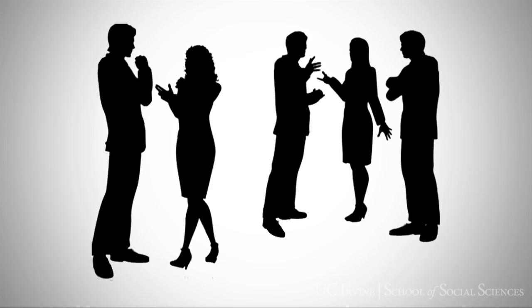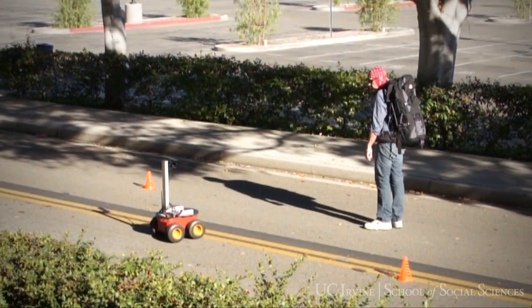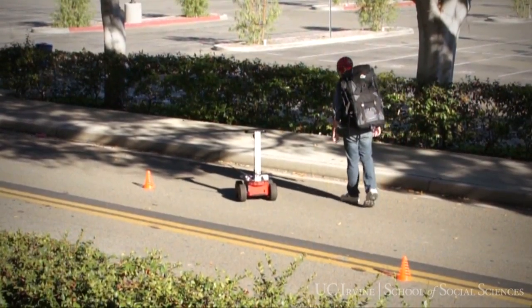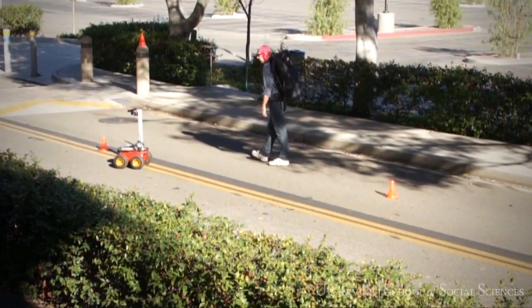While the current technology involves the use of the somewhat bulky backpack system seen here, people elsewhere are hard at work miniaturizing all components used in the system. This will allow for the transfer of this type of system out of the laboratory and into everyday use. Work like this will likely find application outside the lab, particularly for control of autonomous vehicles and robots.